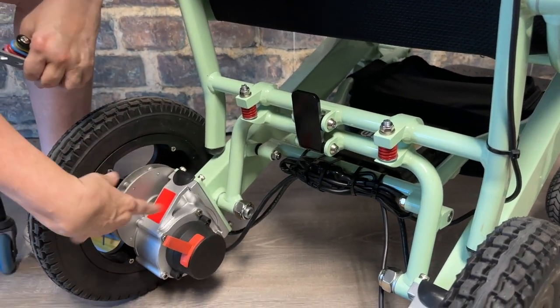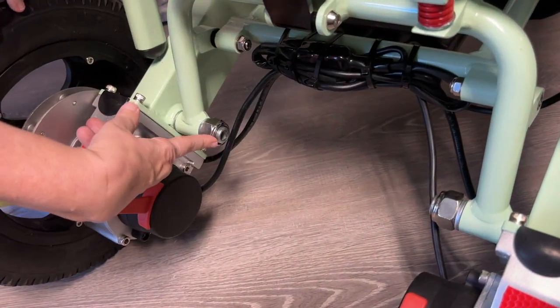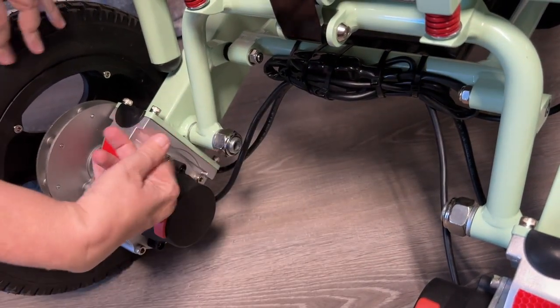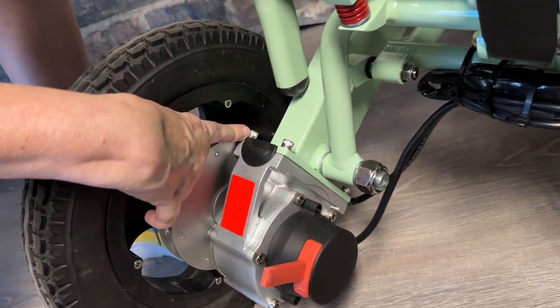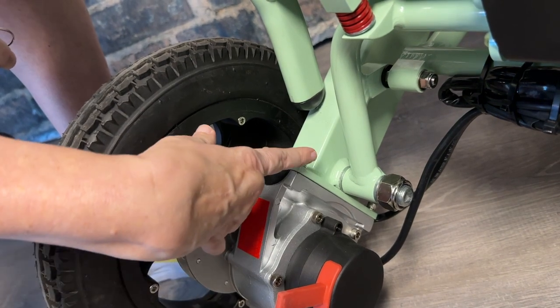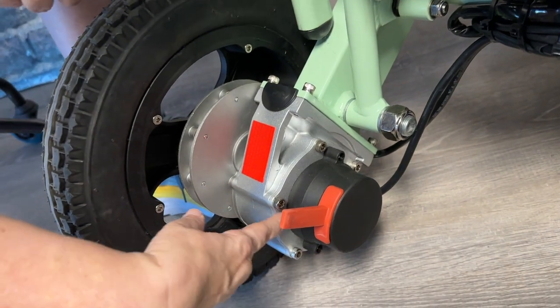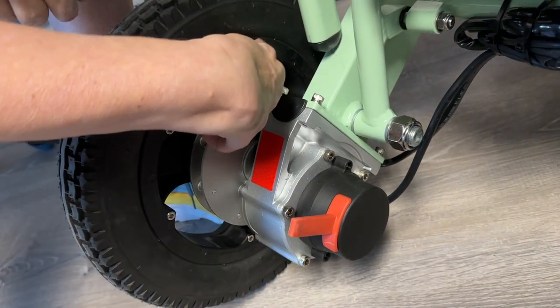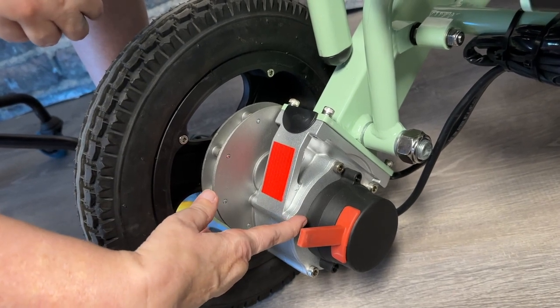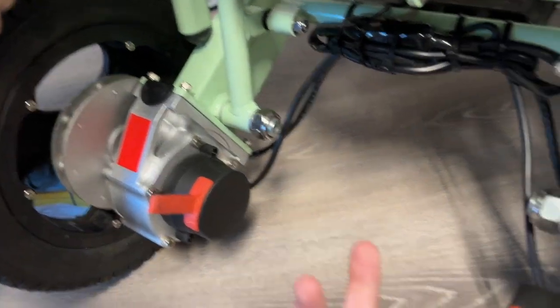Next, look at the lug nuts on both sides of the chair. This very large lug nut you rarely have to tighten, but spot check it. Then check the bolts that mount the frame to the motor wheel, and also the bolts on the motor wheel housing, rim, and tire. Those bolts you do not need to tighten — we've already taken care of that at the factory — but please spot check to make sure they're not backing out.